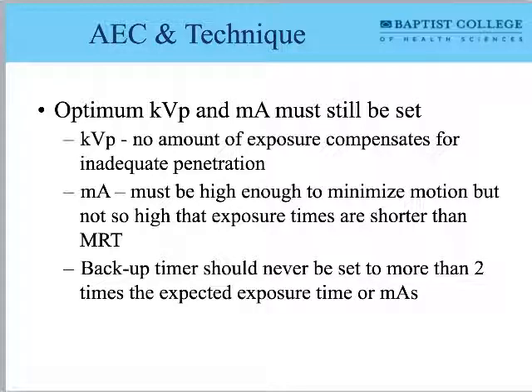That's correct. What we have going on in this illustration is an x-ray that's incident on a patient. We call that the primary beam. It exits the patient, and we now call that the remnant beam. It's whatever still exists after that differential absorption that happened inside the patient.